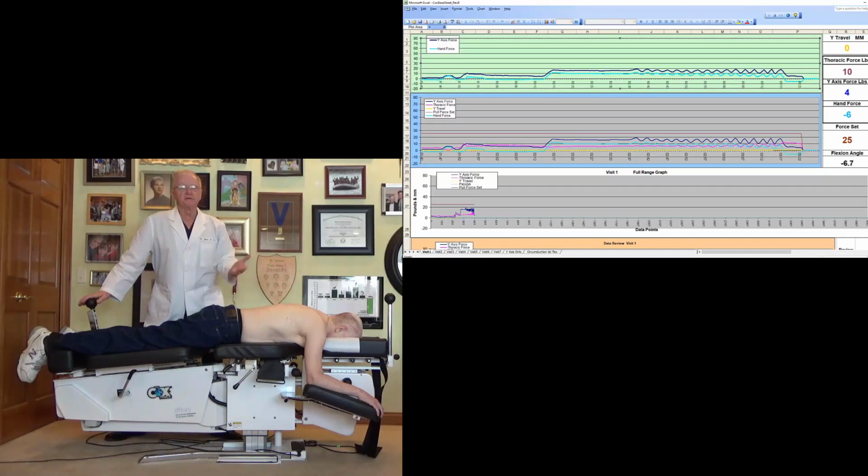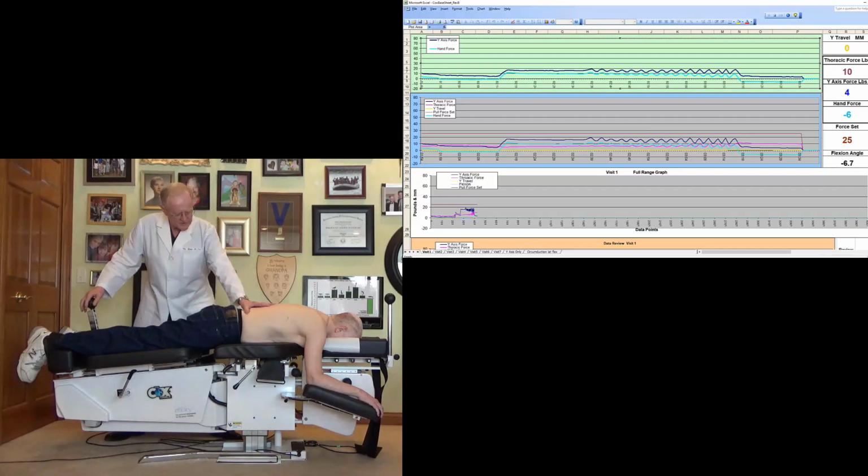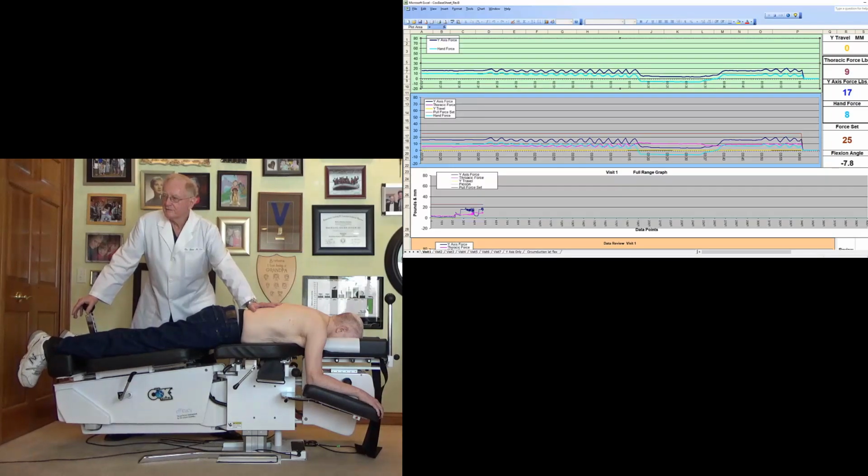Now imagine if I'm treating a 75-year-old lady, very frail with comorbidities, that 2 pounds can be much more suitable for tolerance than if I went to 8. But with this patient, I'm going to go to 4 pounds now. I move to the taut point, and then with that chart, and you'll get so you don't have to follow that visualization to know 4 pounds. Here's 4 pounds. Now you watch the chart and see if that's 4 pounds. I'm going from 14 to 18.